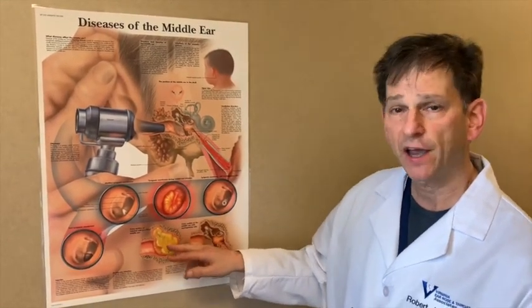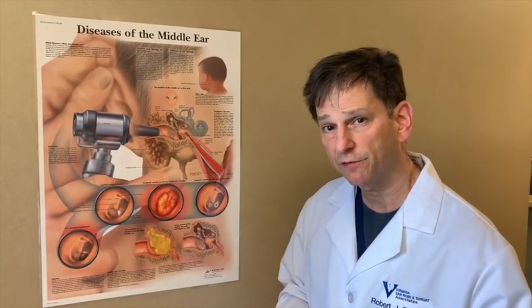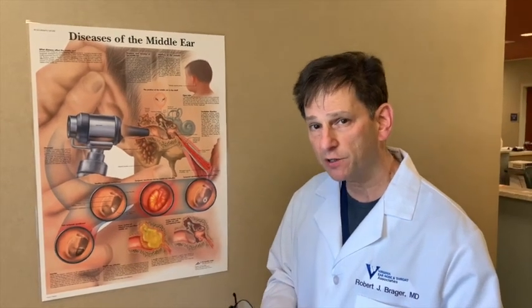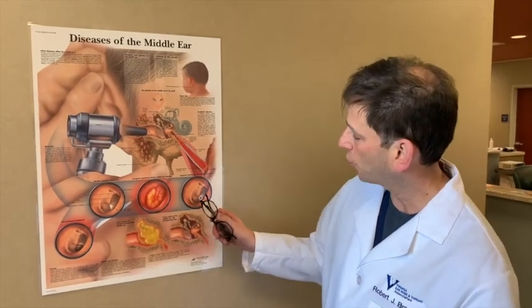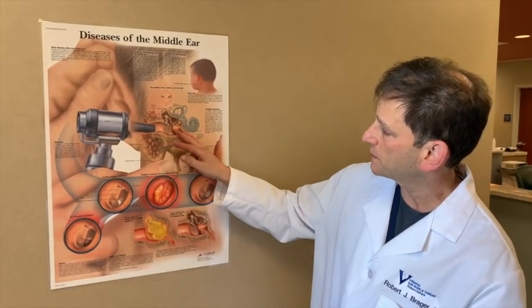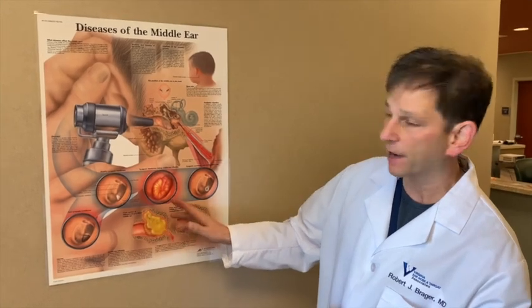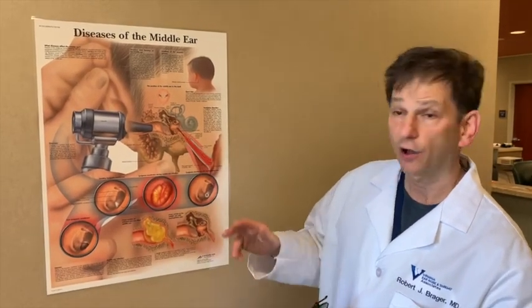When it becomes an infection, it has to be treated when it causes symptoms of significance. When the infections become frequent, when they do not respond to antibiotics, they can sometimes benefit from the procedure called ear tube insertion, which is seen right here. The ear tube allows the fluid in the middle ear that's built up right here to get out, and the infection can drain out and allows air to get in. That is how the tube works.